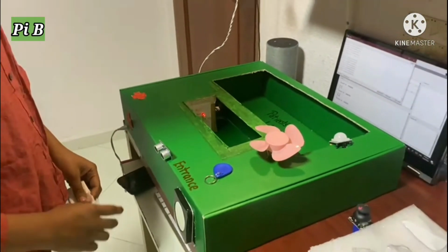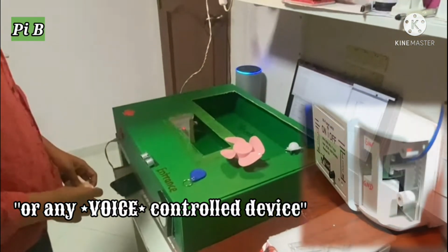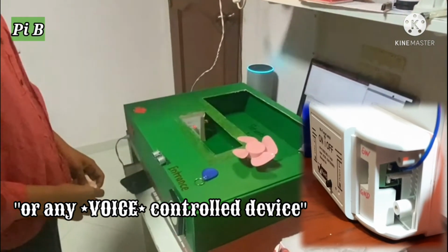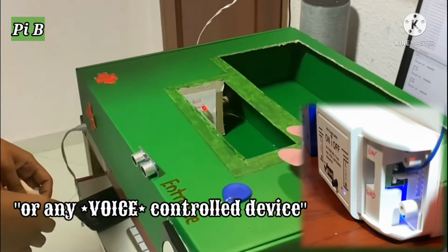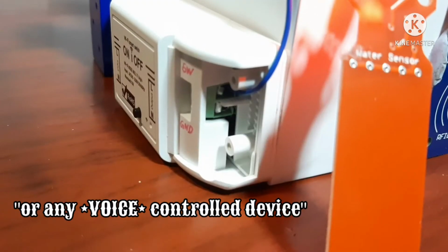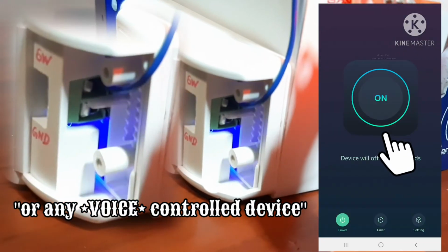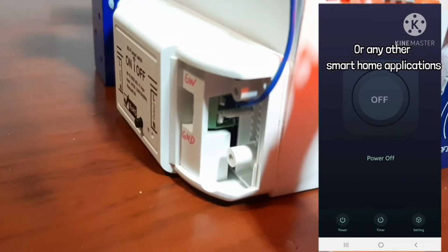In cases where patients are not able to move, they can always ask for help through Alexa. Alexa, I need help. Okay. A Wi-Fi switch is connected to the joystick button and will turn on once triggered by Alexa.